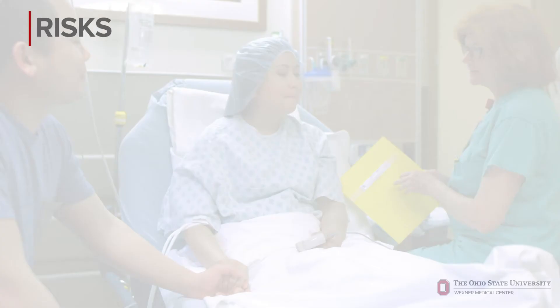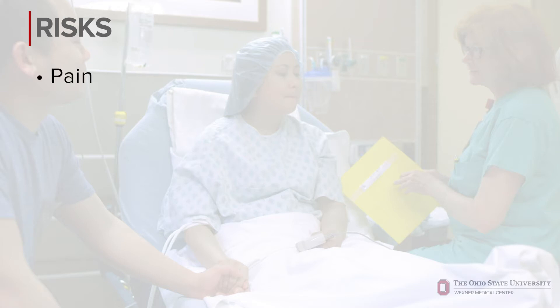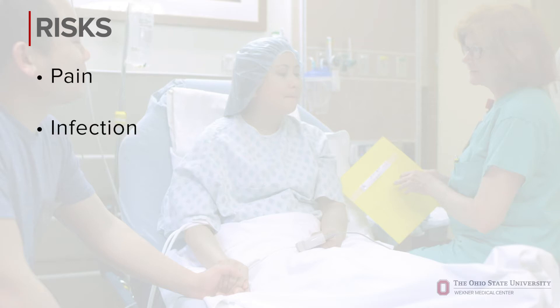The benefit of this procedure is to remove a device you no longer need or to address those issues. The risks of the procedure include pain, infection, and bleeding. We minimize these risks through the use of anesthetics, sterile techniques, and minimally invasive small incisions. Some patients with sensitive skin might have soreness or bruising for a few days as well.